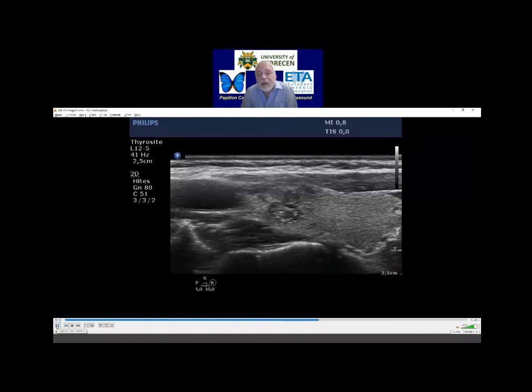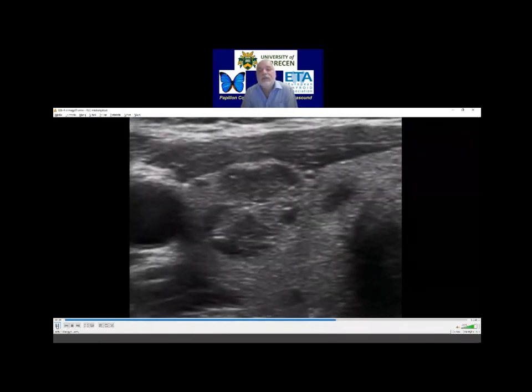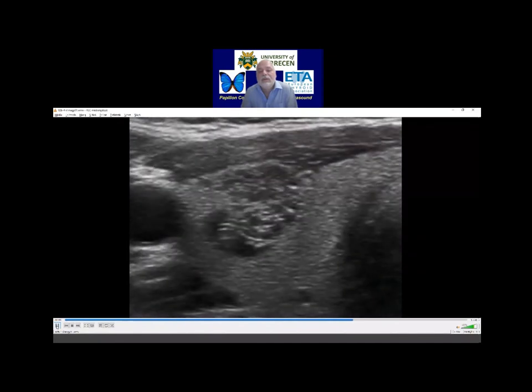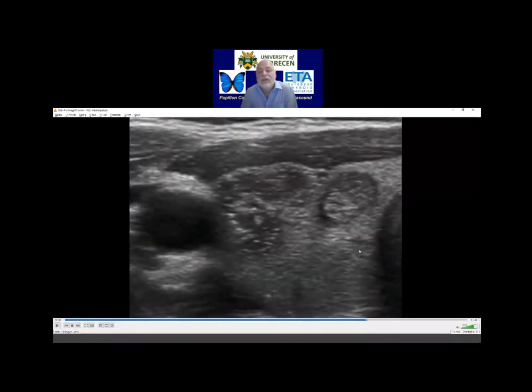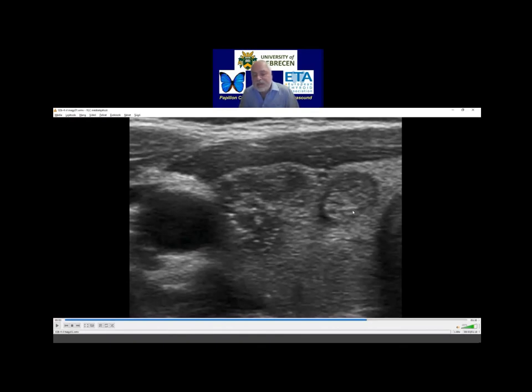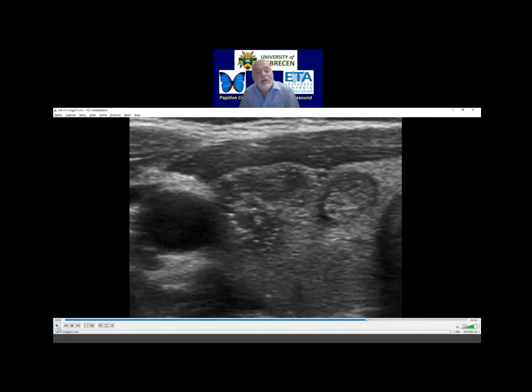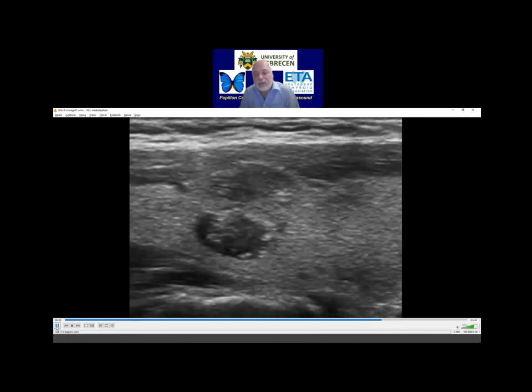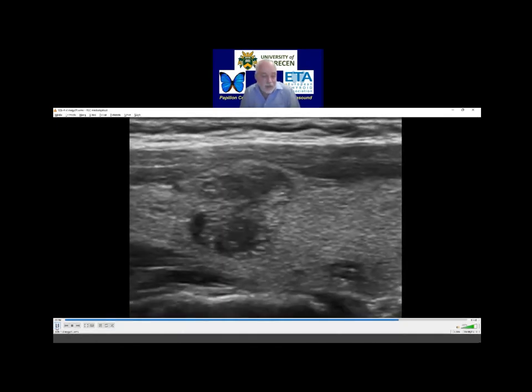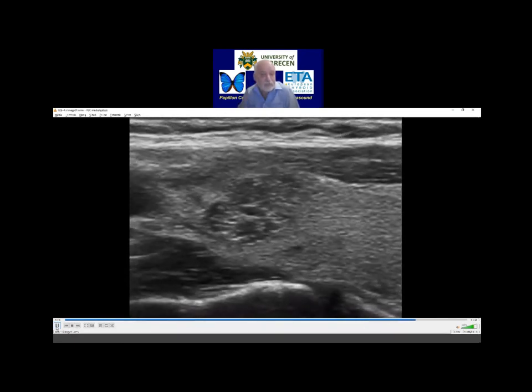Hopefully we will see again this small nodule in the video. It is not evident whether these are dorsal to cystic areas, but the presentation of backfall figures and the presentation of connective tissue are almost the same. Both are characterized by the synchronous presence of lines and granules. It has no relevance to differentiate the connective tissue from backfall cystic figures, but I mention here that these are very similar figures.